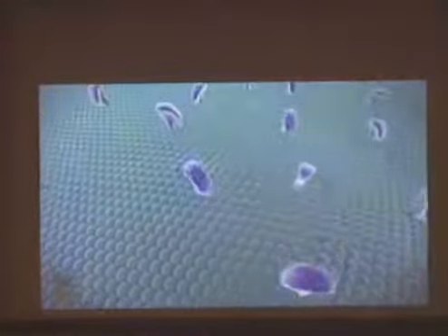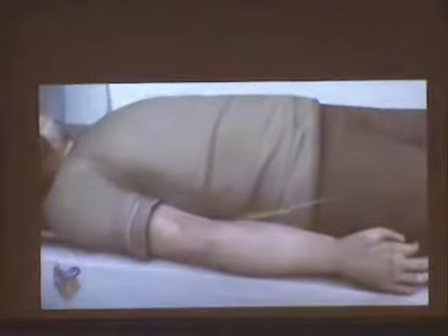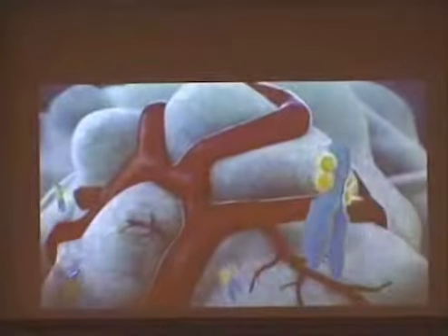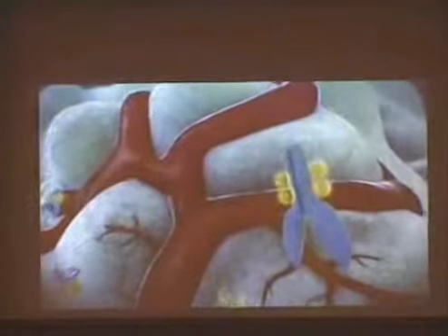So obviously the concept, and this is in collaboration with the University Medical Center in Groningen, is that you would have, for example, receptors on the cellular membrane of a cancer cell, and this is what you would like to be able to target better, and not just see cancer, for example, on anatomical features like what's happening now, or with non-specific dyes, but instead inject, for example, antibodies or other small molecules that will carry a fluorochrome and will identify those cellular receptors.